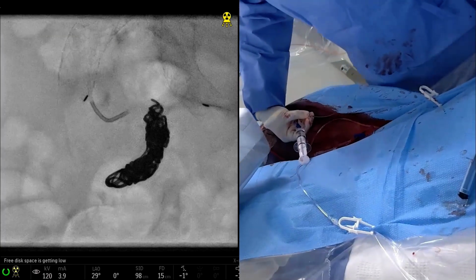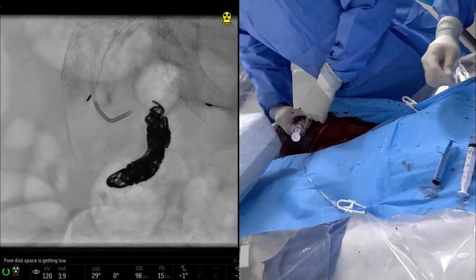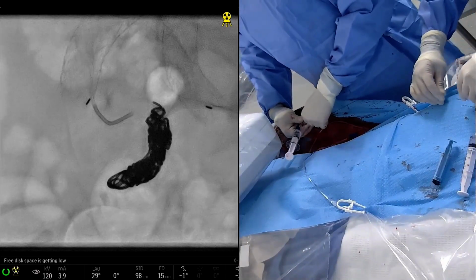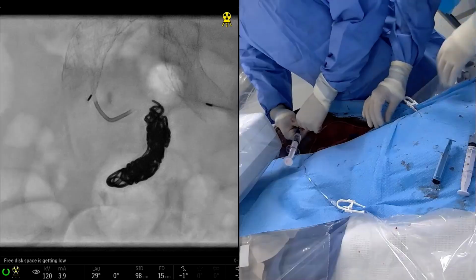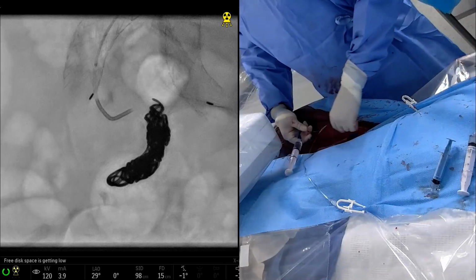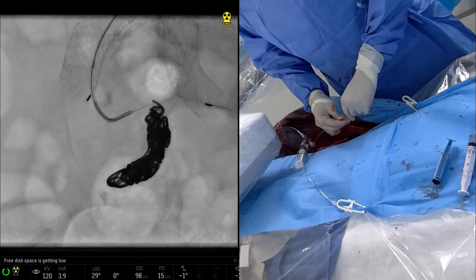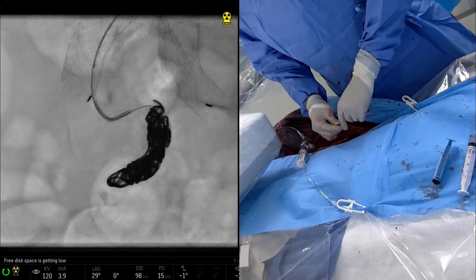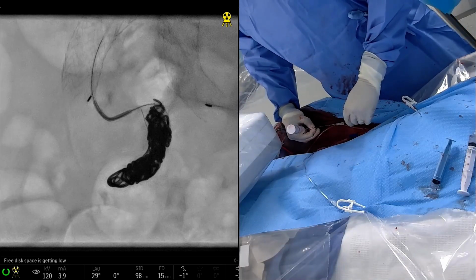If the patient's on warfarin with high INR, do you do anything different with the radial access or cocktail? Nope, we keep it the same. We haven't published specifically on blood thinner safety, but we have on patients with high INR and low platelets, and we haven't had any issues. How low platelet will you go to? Unless they're actively bleeding, we've run with it.